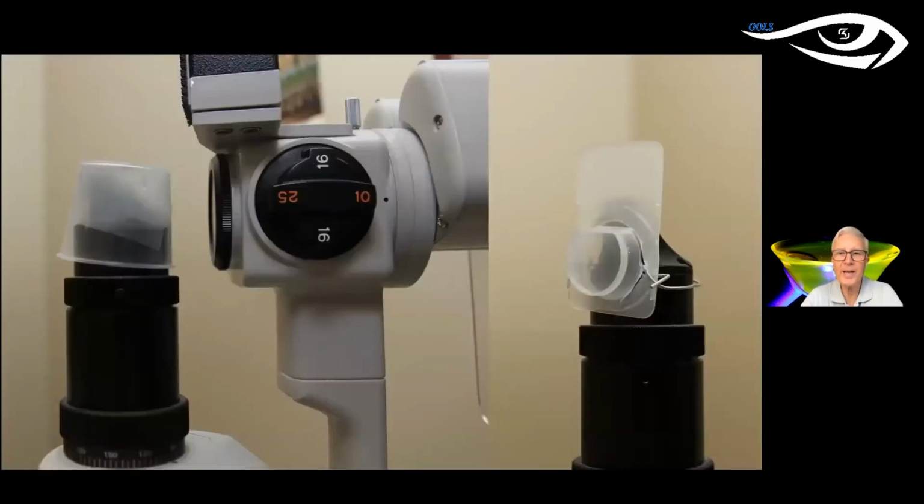Now, you can be pretty creative with this if you don't have a fancy slit lamp. If you have what we call a Zeiss type slit lamp with the light source not in a column, then you can get a little plastic cup like you see on the left and just drop it over the light source. Or on the right, that's a daily disposable lens case, which you just take and use a paper clip to bayonet it. So easy, inexpensive. Some people will take a piece of tape, Scotch tape, frosted tape, and put over it, but then you have to deal with the residue of the glue on the mirror. So I'm not a fan of that.